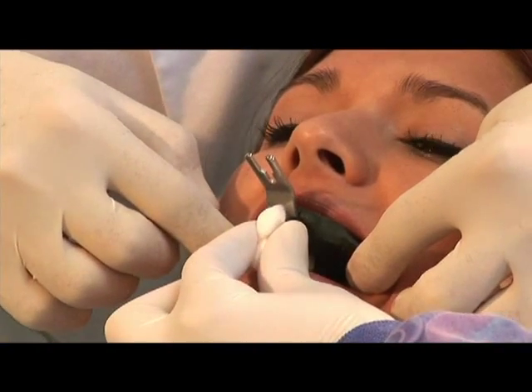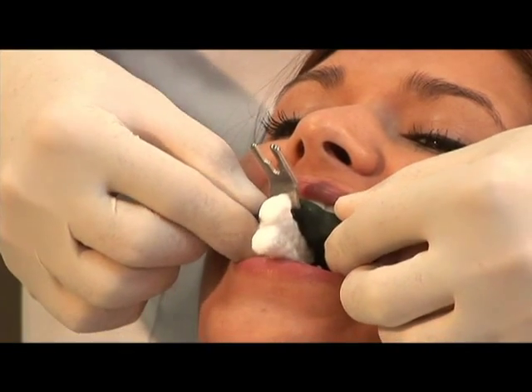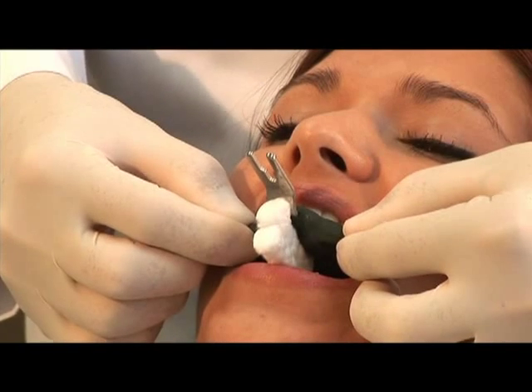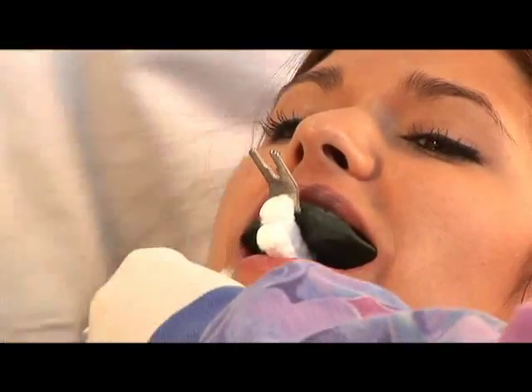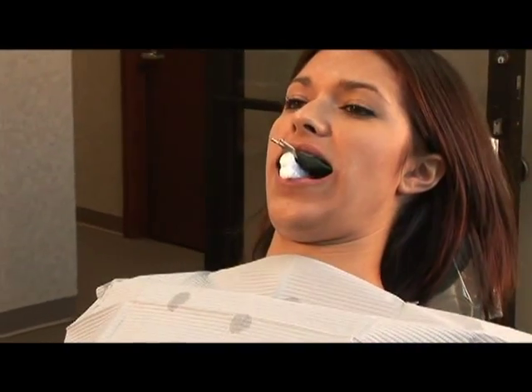Support the bite fork underneath by having the patient bite on cotton rolls. Occasionally, the bite fork may need to be supported by the assistant during the recording of the facebow registration. With the patient keeping very still, raise the chair up to a seated position.